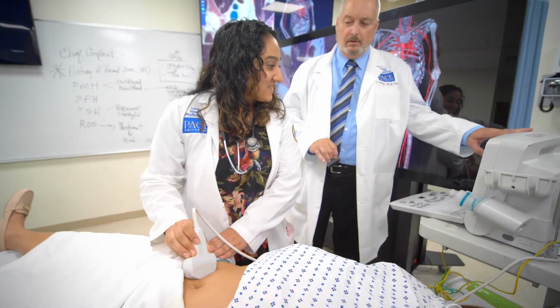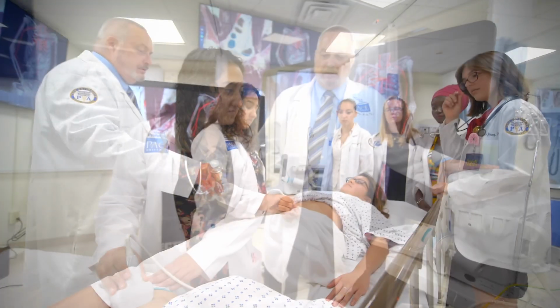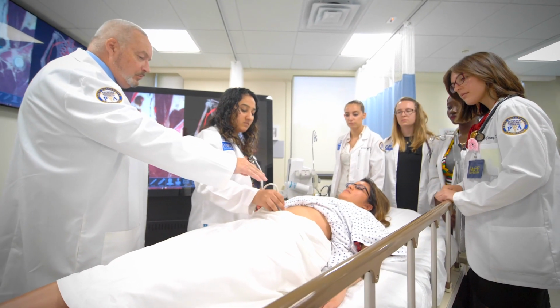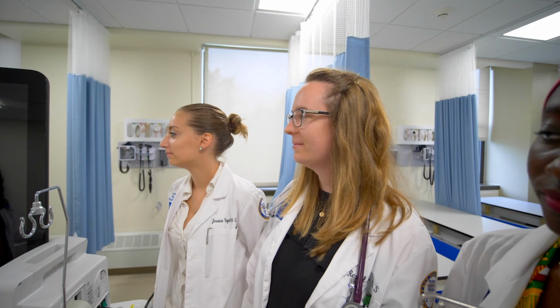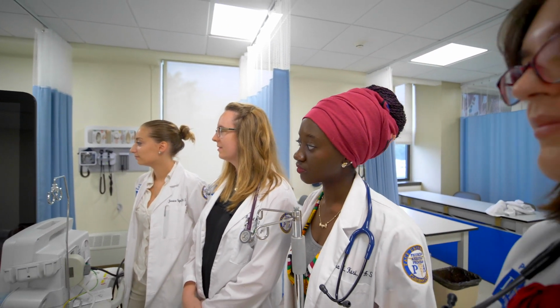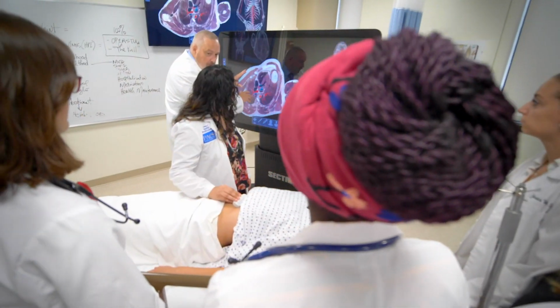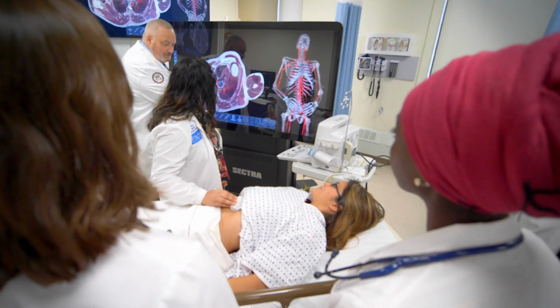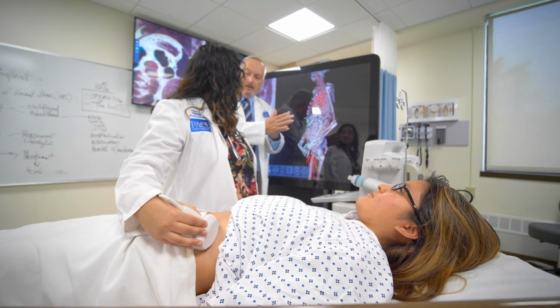Another application that we have found is trying to learn other skills. In this case, we're introducing ultrasound into our curriculum. One of the challenges for the students is to look at the ultrasound monitor and understand what the anatomy is. We're not used to seeing ultrasound images, and by using the 3 planes and the virtual cadaver at the same time, we've been able to utilize the table to enhance their learning.